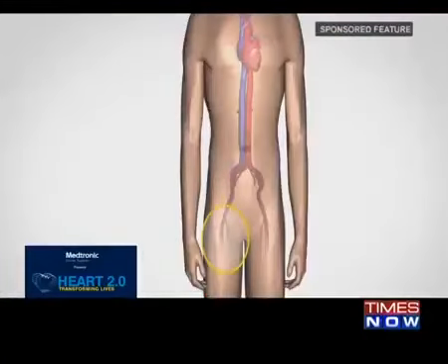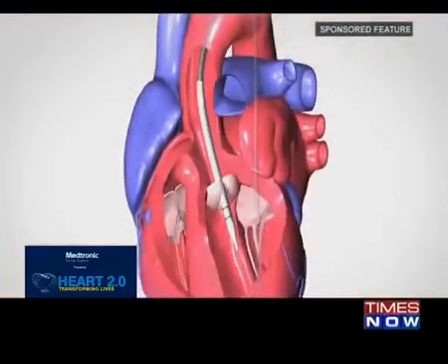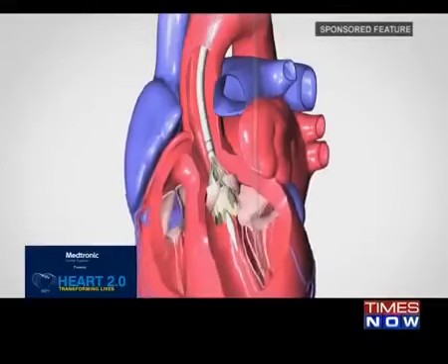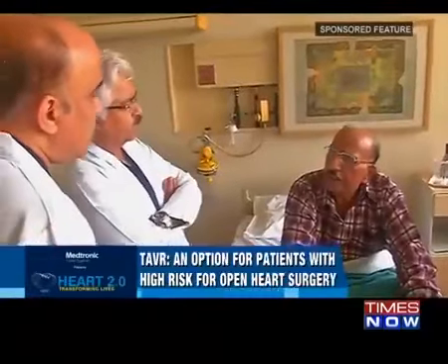In this catheter-based procedure, a physician makes a small incision, usually through an entry point in the leg, and guides the new valve into position to replace the failing aortic valve. The device then expands into place and takes over the original valve's function to enable oxygen-rich blood to flow efficiently out of the heart. For those who have moderate to increased or severe risk at aortic valve replacement, TAVR is the alternative. TAVR is not the alternative for routine young patients having aortic valve replacement. Aortic valve replacement surgically is a very robust and tested out procedure. But when the risks of the procedure rise is when TAVR comes.